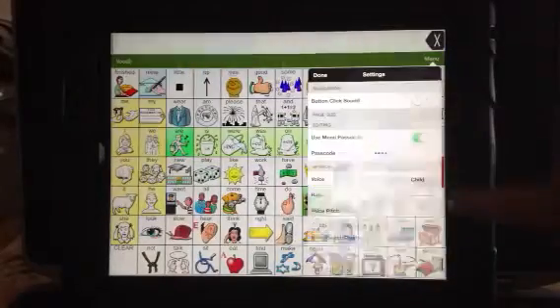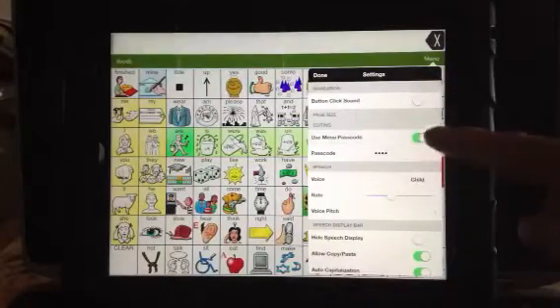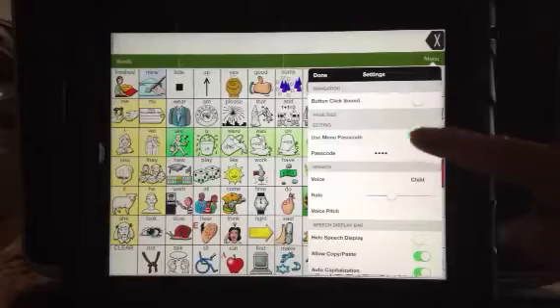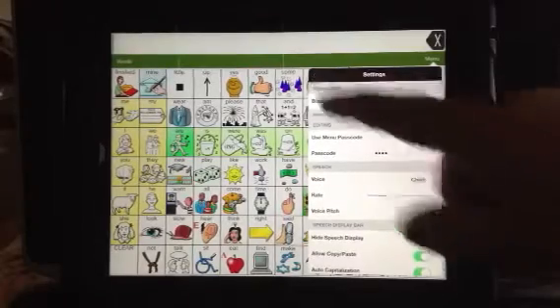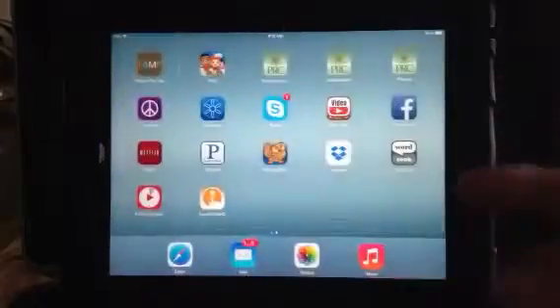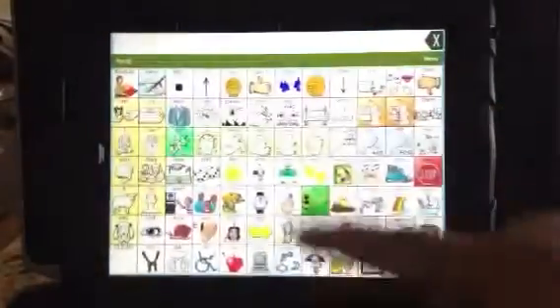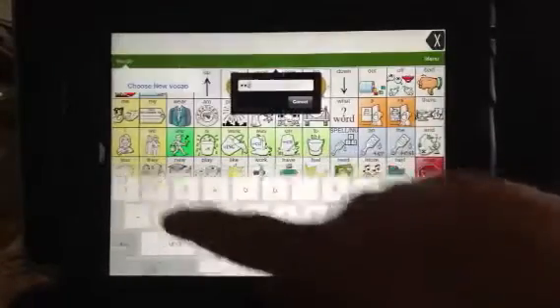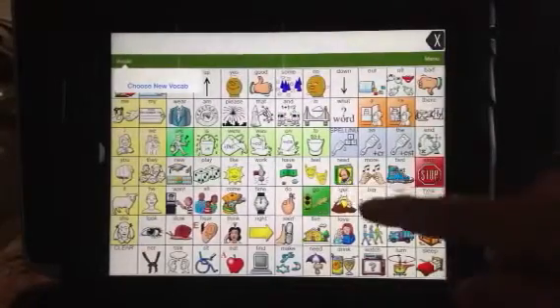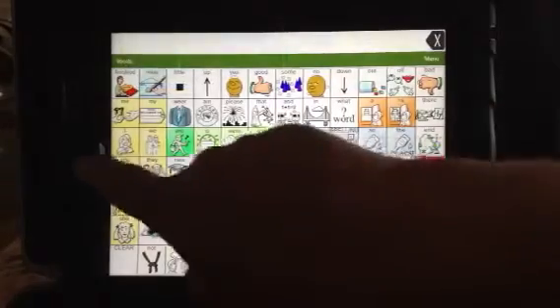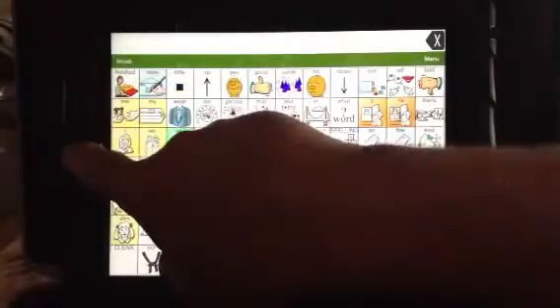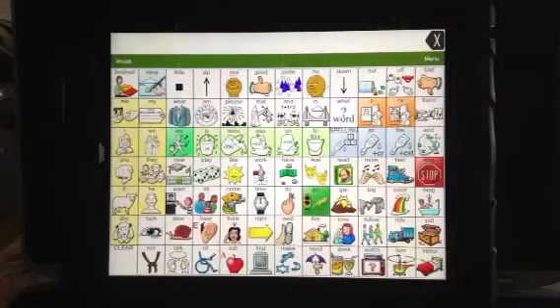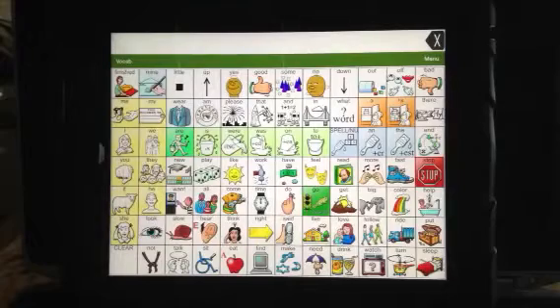Now, the reason I'm not really focusing on this method — it is one way to do it — is the problem with this: if the child hits the Home key, they get out of the app. So that won't do you much good. It'll stop them from changing things within the app since they'd have to know the passcode, but it doesn't keep them in the app. And these kids, as you know very well, they'll touch that Home button.